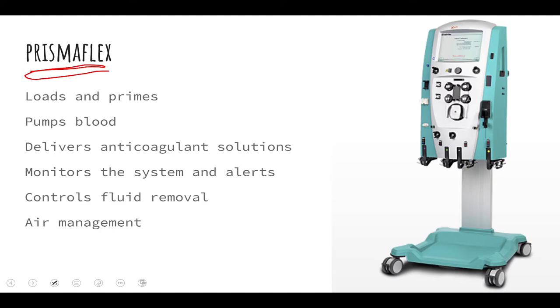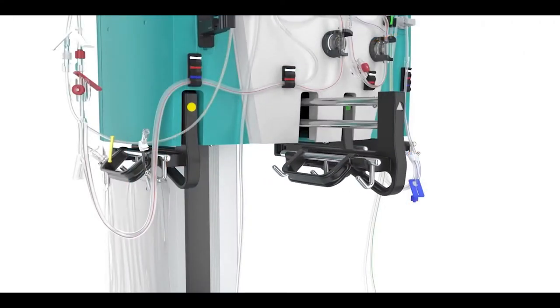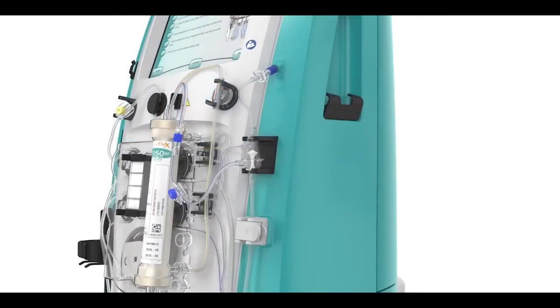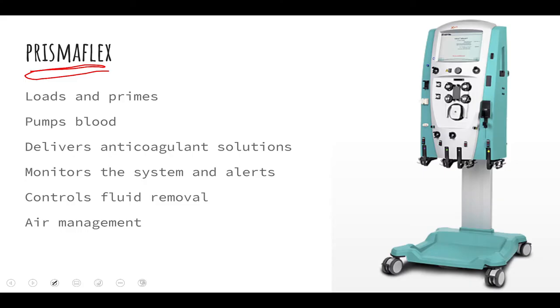The Prismaflex controls fluid removal rate automatically, saving you from having to manually add and subtract fluid going in and out of the patient. It also handles air management — you do not want to inject any air into the patient. As blood runs through the tube, there's a chance air might sneak in, so the Prismaflex has a system that detects extra air and allows us to excrete it before it reaches the patient.